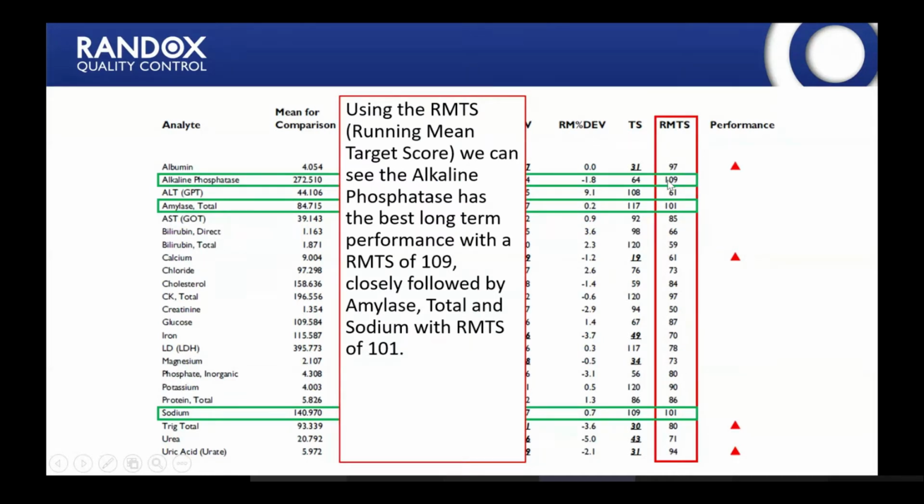So I've highlighted the 3 with the highest running mean target score. Alkaline phosphatase is the highest at 109. And then you can see amylase total and sodium both have a running mean target score of 101. Anything over 100 is deemed to be excellent performance. So these 3 parameters are running with excellent performance. You can see there are some other ones here at 97, there are 2 at 97, another one at 94. So overall, the performance of this lab is good. You can keep a look here, so you can see the lowest here is 50.